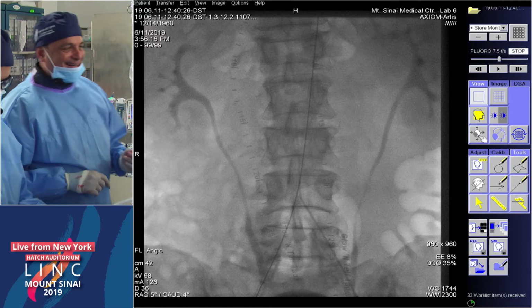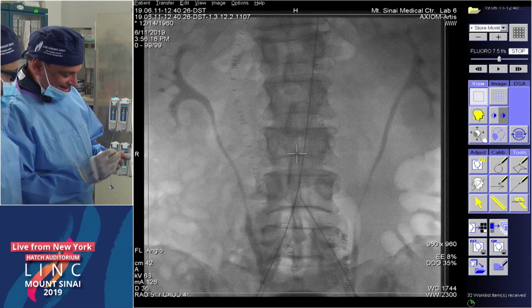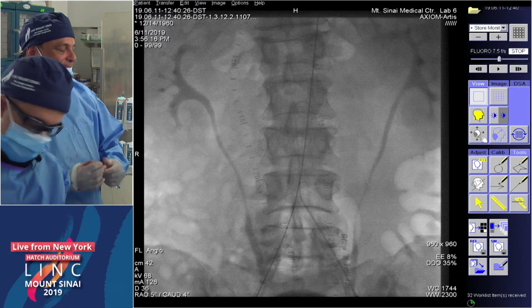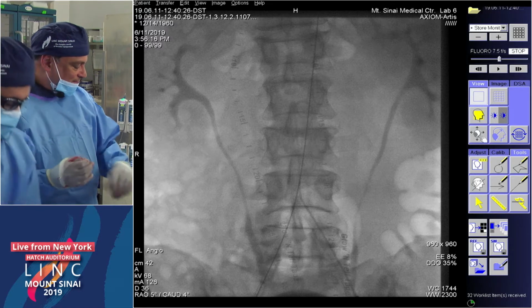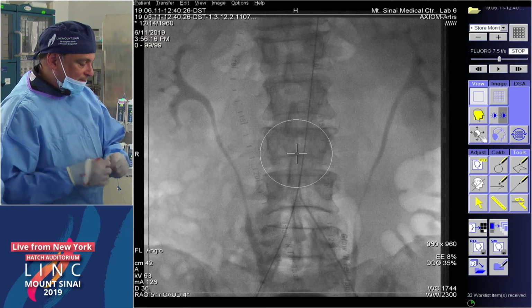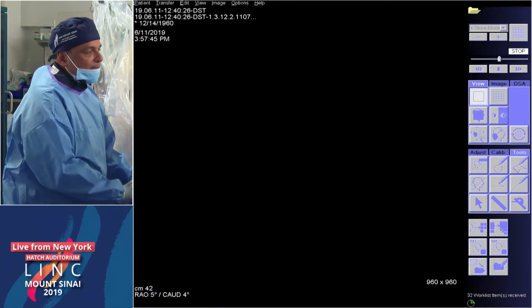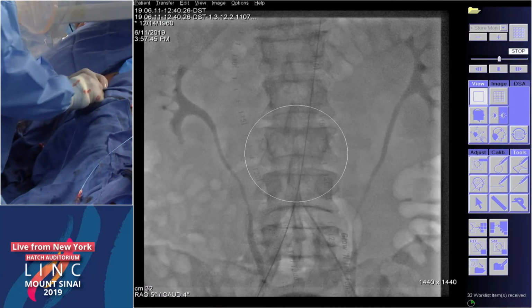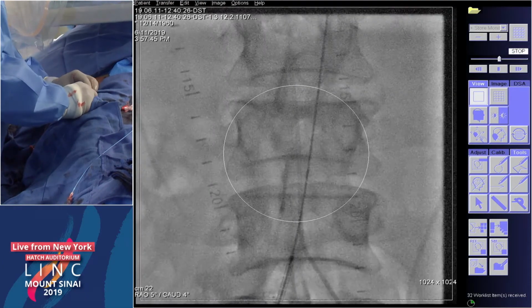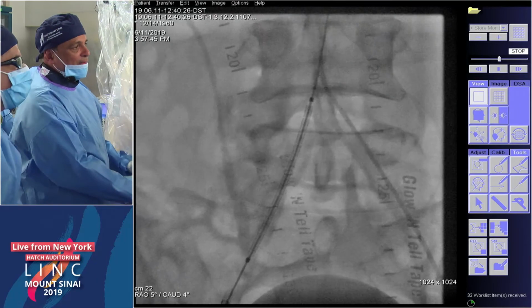No. Okay, randomized trial. I would put similar stents in there. Because again, with the interaction and the compliance of them, both are balloon expandable. I think both would work very well here. Quite candidly, I'll play a member of the program committee here. Since we just saw a Livestream, I would go in and put a VBX in so our audience can see the two different stents and how they deploy. Yeah, so I too agree with you, Jim. Perfect, and you are a member of the program committee.